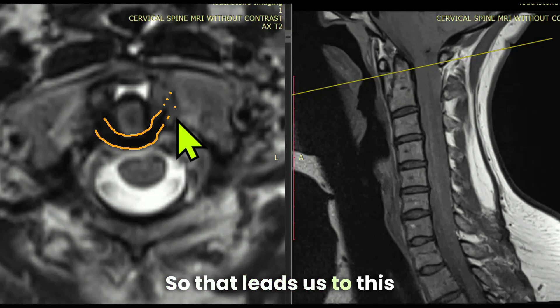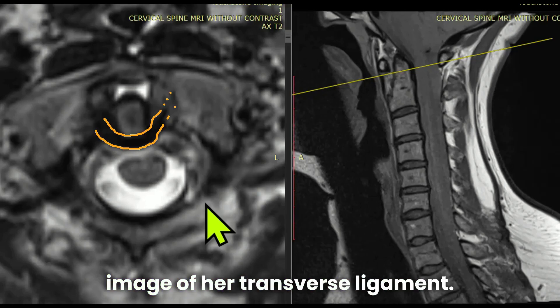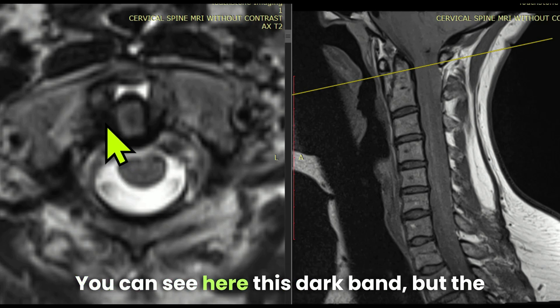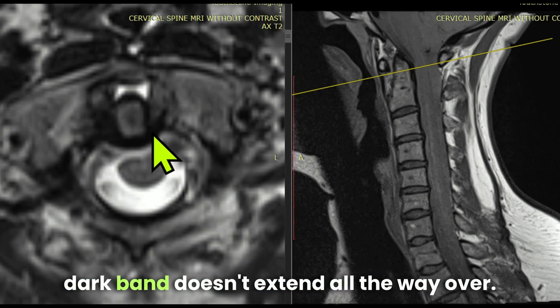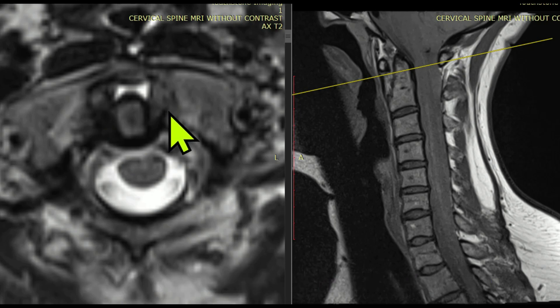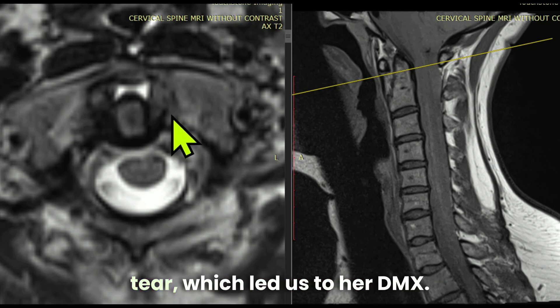That leads us to this image of her transverse ligament. We got this image with a specialized head coil. You can see this dark band, but the dark band doesn't extend all the way over — it seems to be missing here. That could be a transverse ligament tear, which led us to her DMX.